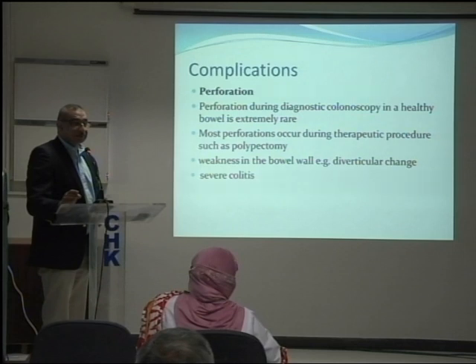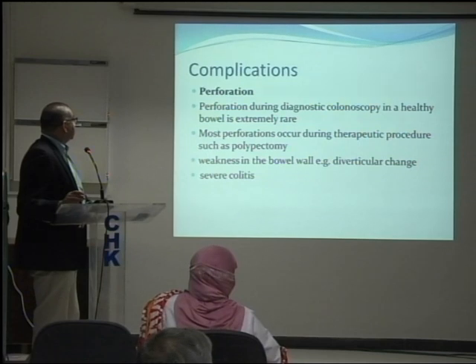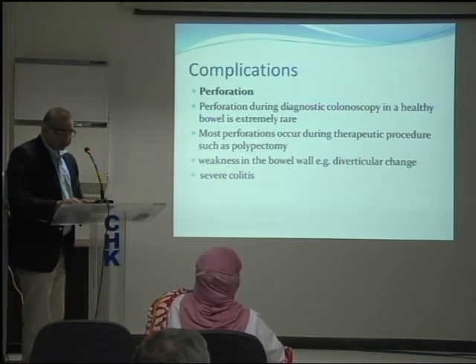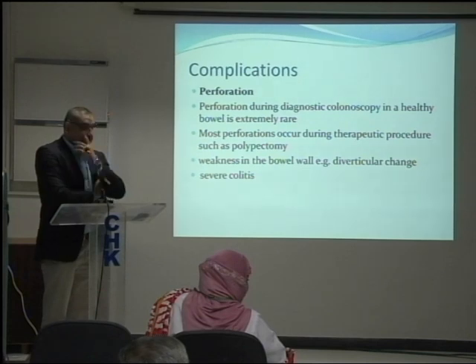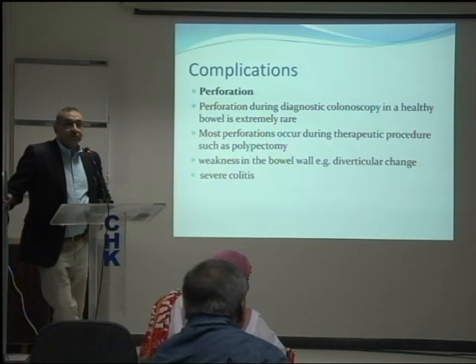Two. The rest haven't. So what was after surgery? After surgery, okay, fine. What did you do? I just wanted to know what they've done. I've seen a couple, but then I did one myself. Was that a diagnostic? That was diagnostic for bleeding PR. It was massive bleeding. And all of a sudden I found myself looking at the peritoneum. Oh, right, okay. So we stopped there, and we took that patient after preparation to theatre and we had to surgically correct it. Right, okay.